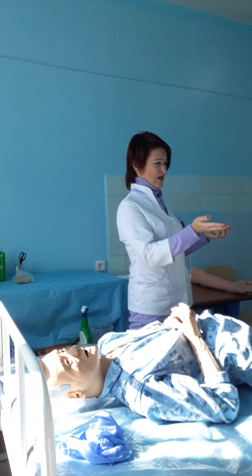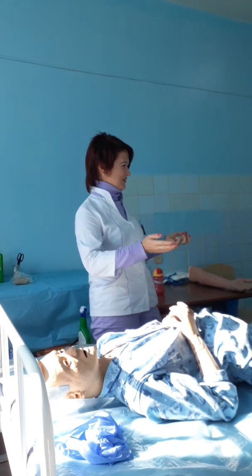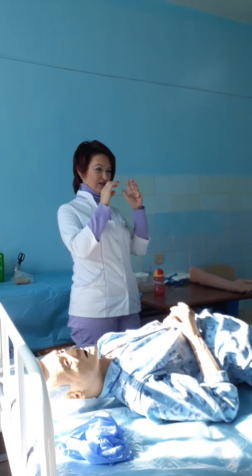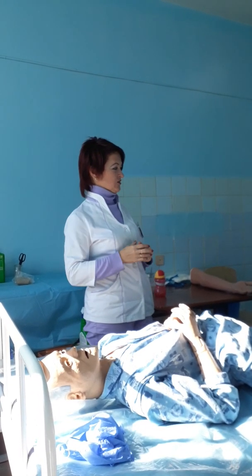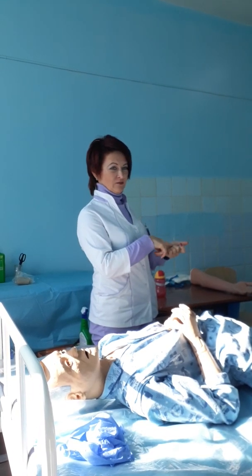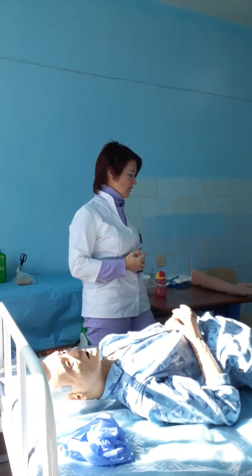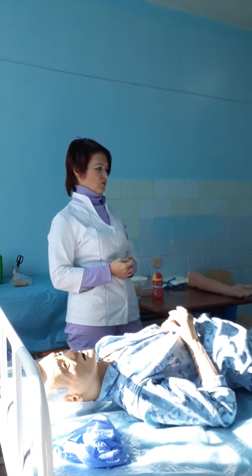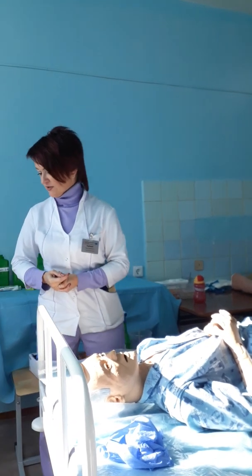In the administration record you will see the ward number, doses, percent and concentration and volume, how many times, way of administration, time. Okay. And afterwards, you start to prepare for this manipulation.